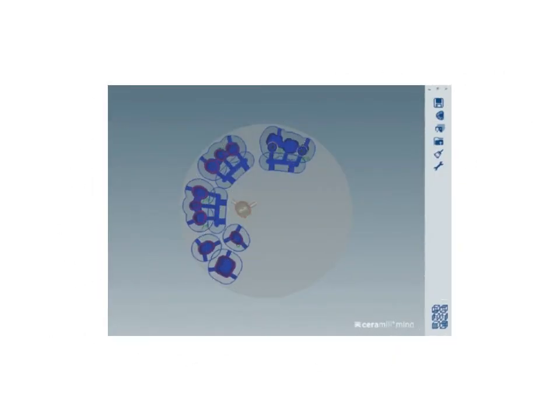When the final design is accepted by the clinician, the lab technician can use CAM software to nest the restoration in the block or disc of material to be milled and control the manufacturing strategy. In the case of additive manufacturing techniques, for example laser sintering deposition, it is also possible to determine the location of the restoration, the number of layers, the width of every layer, and so on.